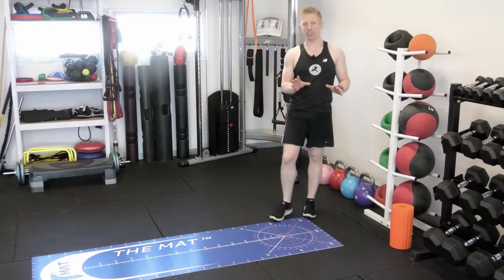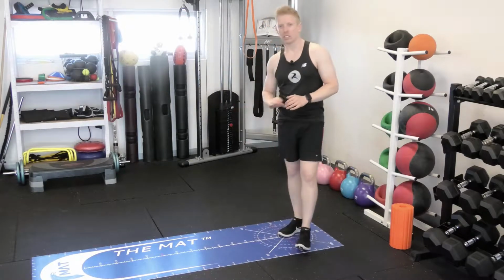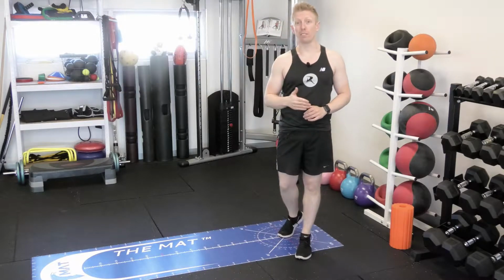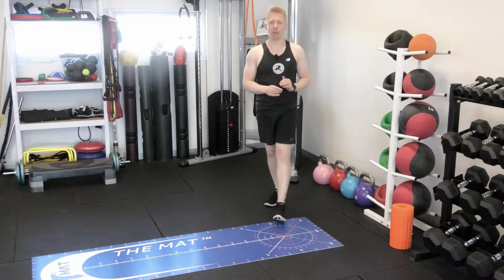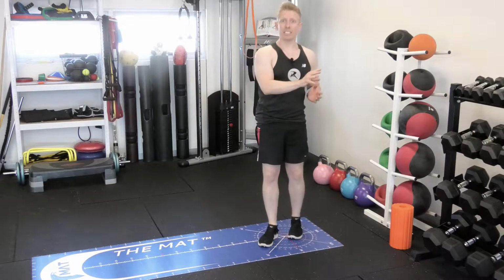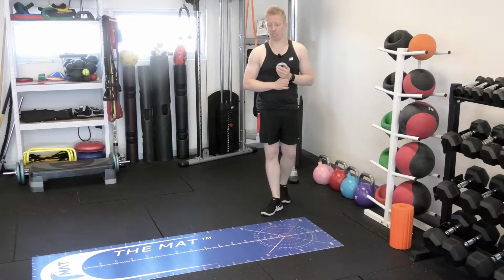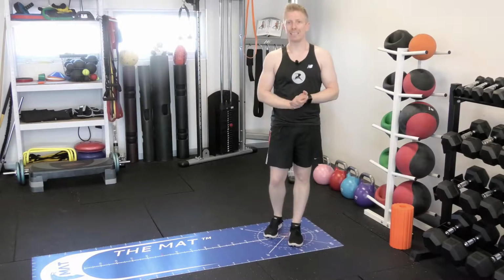Well, the balance was definitely trickier on that right side, but when we start to look at the average, it's actually quite similar side to side. We're looking at about 145 centimetres or so side to side, which is a little bit maybe surprising for some of you out there, given that my weight bearing lunge and my star excursion balance test from the video yesterday had such big discrepancies. So obviously the mat's a really useful tool to be able to quickly and simply get that objective data. But there is another way.